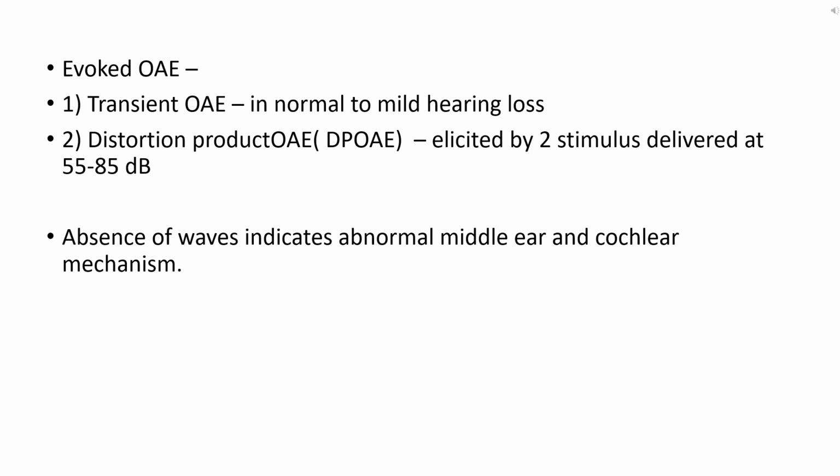There will be very small latency between these two sounds. They are presented almost simultaneously. So of these two sounds there will be a distortion product that will generate these emissions, known as distortion product otoacoustic emission. Absence of any kind of emission waves indicates abnormal middle ear response or abnormal cochlear function.